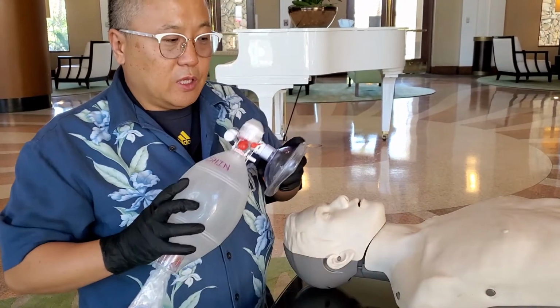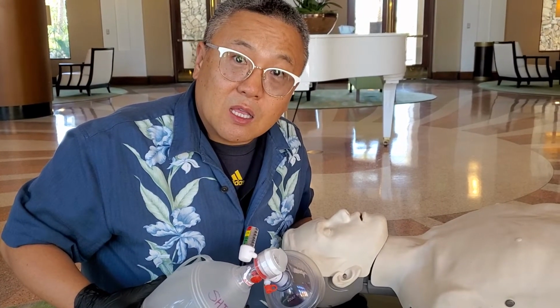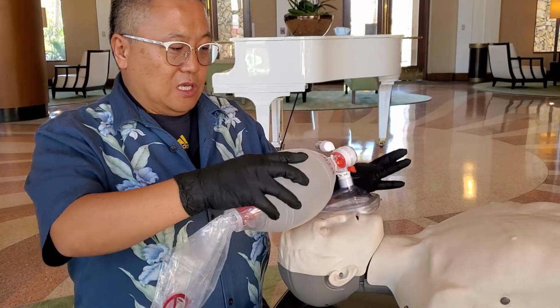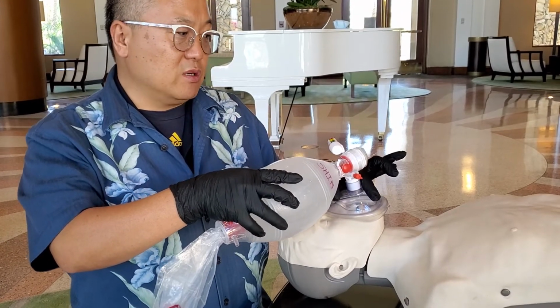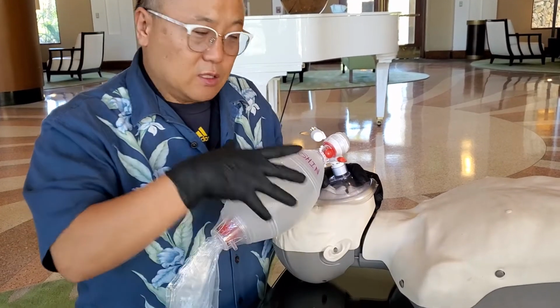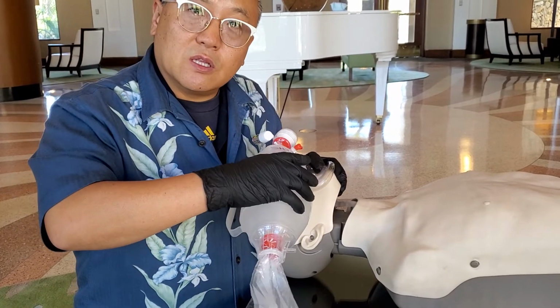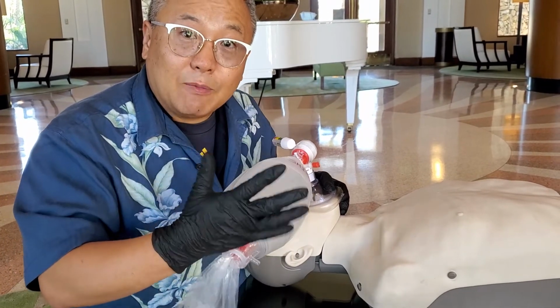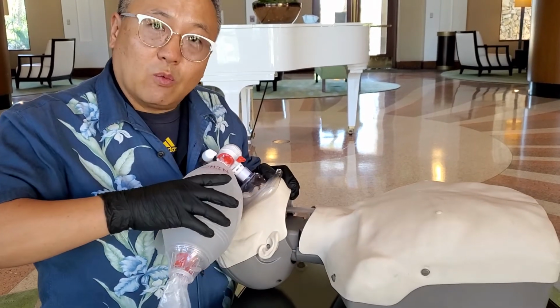So after that, I told you PPV, what does PPV stand for? Positive pressure ventilation. So always remember the CE clamp: C, and your middle, ring and pinky finger grab the jaw, the mandible, right? There's the mandible, grab it, and then squeeze it, and then give them oxygen, okay? Every 5 to 6 seconds, please remember, every 5 to 6 seconds, okay, watch me.